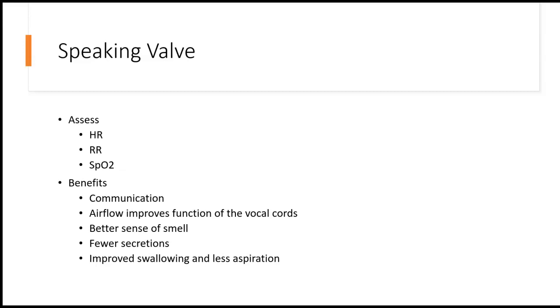So it is very beneficial in able patients to move them to speaking valves early, to help not only with their ability to communicate and levels of frustration, but with the benefits of then utilizing their upper airway more, and that's going to improve their swallow function.